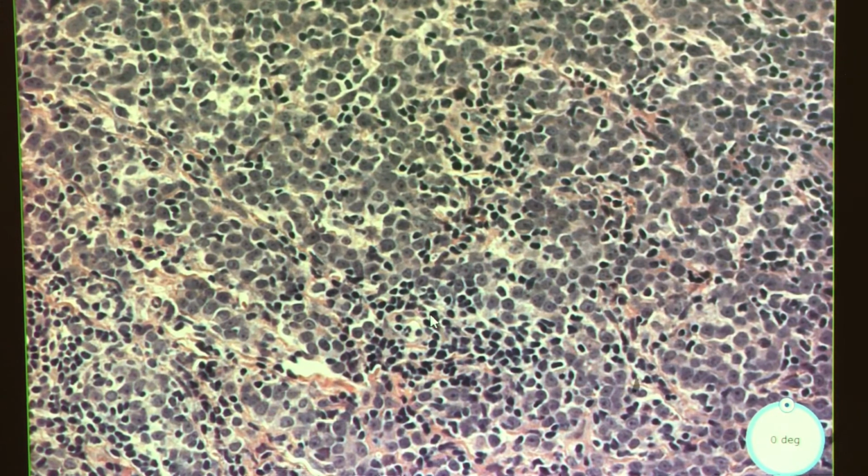Now, when you're looking at lymphoma, pretty much if it's in the breast, better than a coin toss is to say diffuse large B cell lymphoma. And that's because 60 to 80% of all primary lymphomas in the breast will be diffuse large B cell lymphoma. Now, when we look at the morphology, how we can say that is this is a lymphocyte. These cells are nowhere near the size of a lymphocyte. They're huge in comparison.